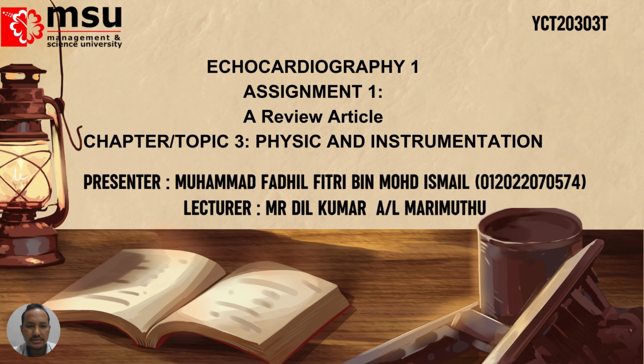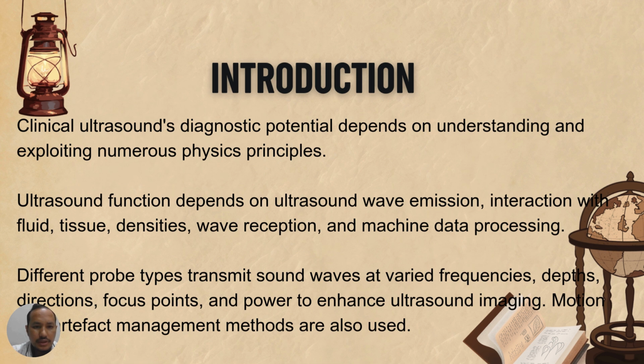Today I will present about physics and instrumentation. Okay, before we go through detail, I will remind all of you as sonographers and technicians: we must remember that the basic physics of ultrasound has five characteristics.